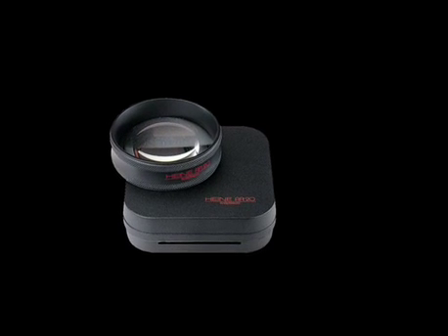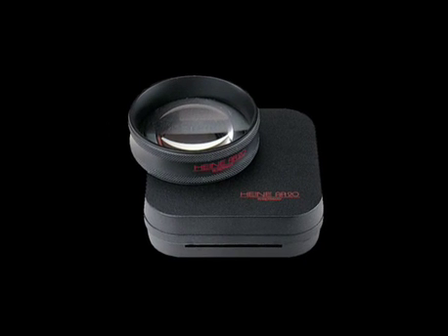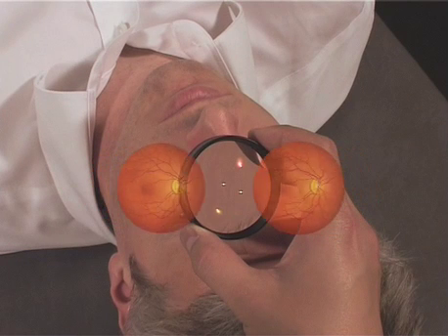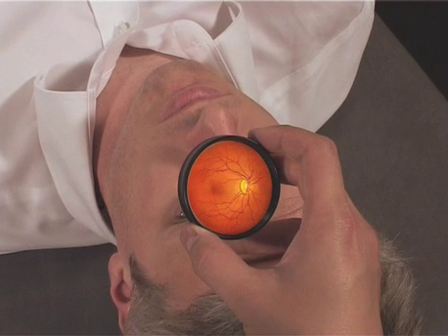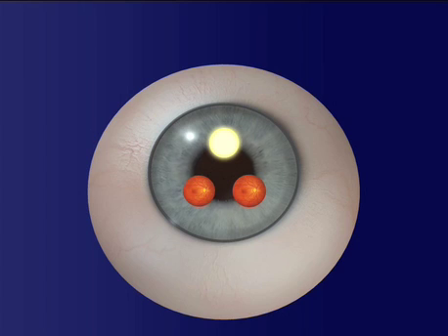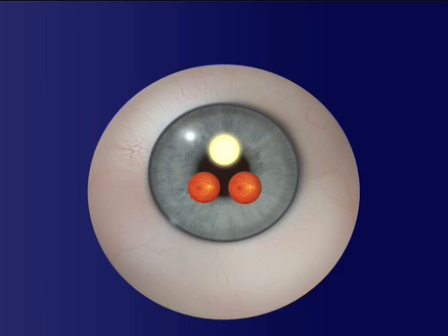A handheld condensing lens is used to create a real and inverted image of the fundus that sits between the lens and the examiner, and this enables stereoscopic visualization of the retina. For maximum stereopsis, the patient's pupil should be well dilated in order to enable all 3 beams to pass through it. If the pupil is poorly dilated, then 1 or more of the beams will fall outside of it, and stereopsis is therefore lost. However, some degree of stereopsis can still be achieved by altering the angle of convergence between the right and left observation paths using the variable pupil function.